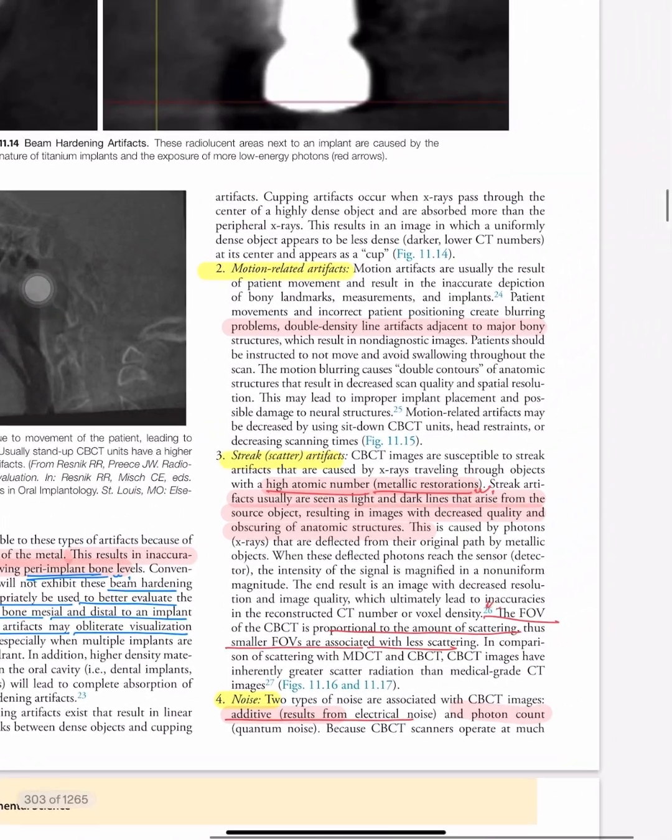Okay, so motion related artifacts. If during the scan the patient moves or does swallowing movements, there would be motion related artifacts. Then streaks and scatter artifacts. If a patient has some sort of metallic restoration, understand that these metallic restorations have a higher atomic number and would definitely produce scattering. If the field of view is large, this scattering would be more evident, and if the FOV is small, the scattering would be less evident.